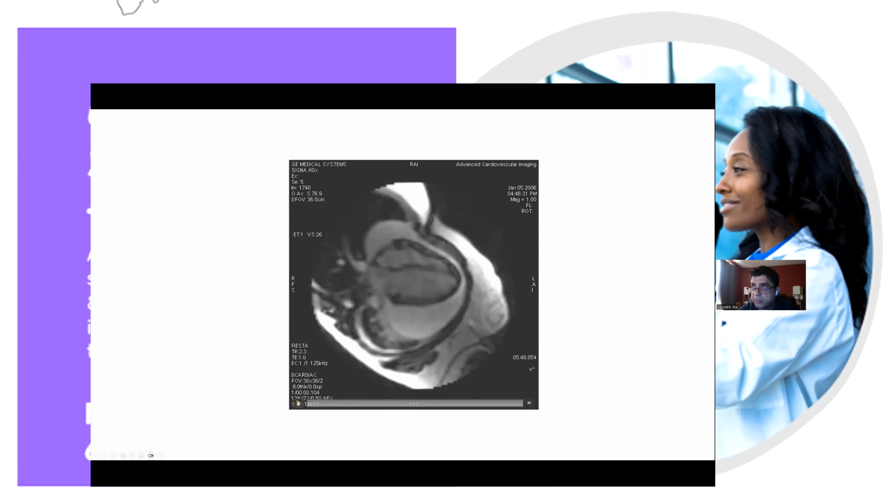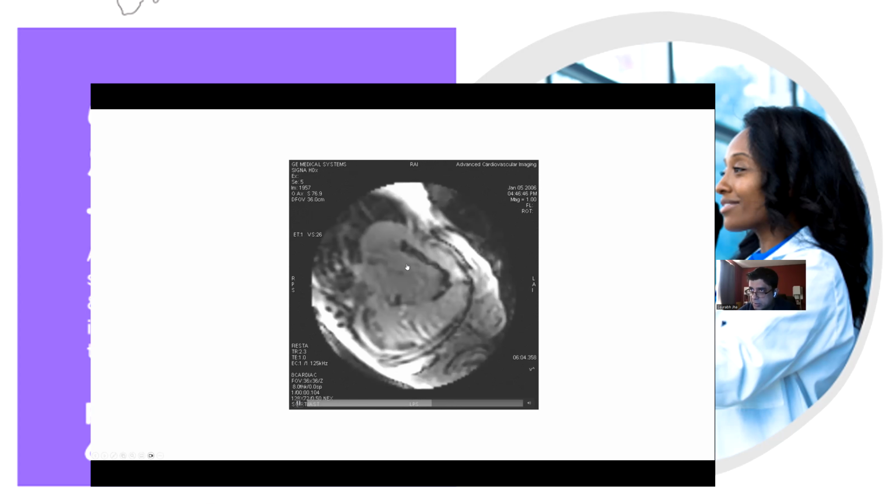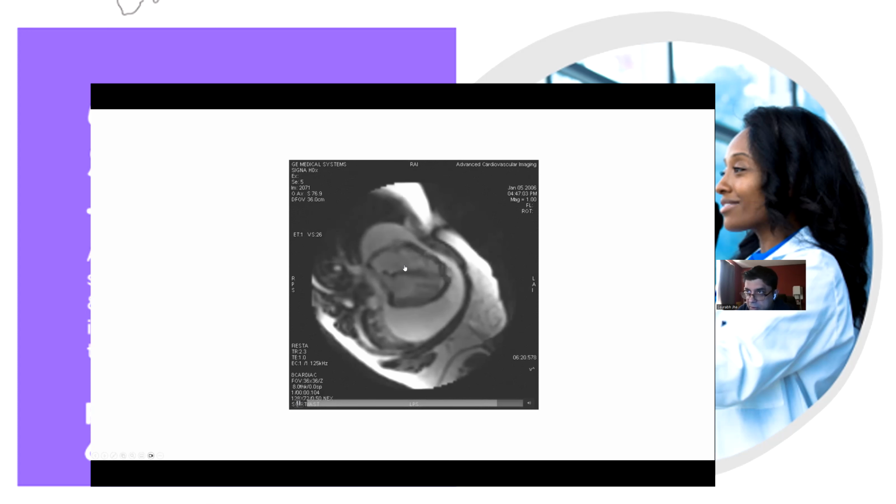So here's an example of a real-time image. This patient has a pericardial effusion, which is pretty large. You can see the right ventricle being compressed by that. It's achieving real-time status because it has a ridiculously low phase matrix, somewhere in the order of 80. Here's another example. Same patient, same idea, and you can see that there's a pericardial effusion and the RV wall beat to beat is being deformed by the effusion.